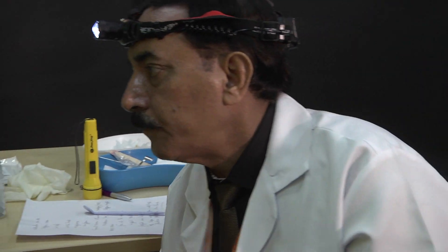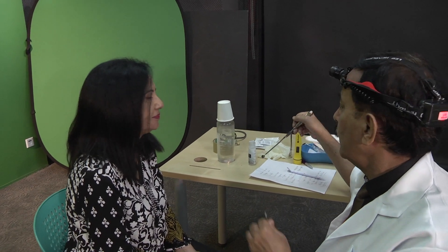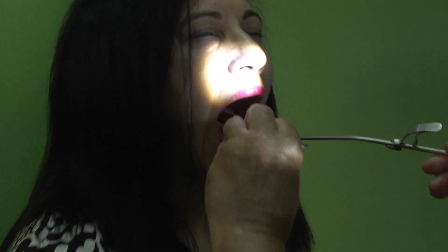So in the usual manner, we will ask the patient to open the mouth. Open your mouth. Then we either warm it in hot water, anti-fog, or on our spirit lamp, we can warm it also. So we introduce the tongue depressor, put it on the base of the tongue, then we go with this.